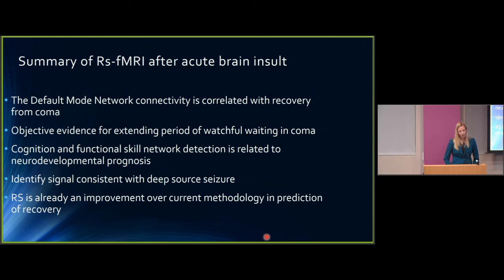So in summary, using resting state after an acute brain insult, we can see that the default mode connectivity does unequivocally correlate with recovery from coma, and this is better than any current testing. And I just want to point out, there has been no other test on the face of the earth or in the history of mankind that has so many individuals tested before it was rolled out for this very sensitive population.